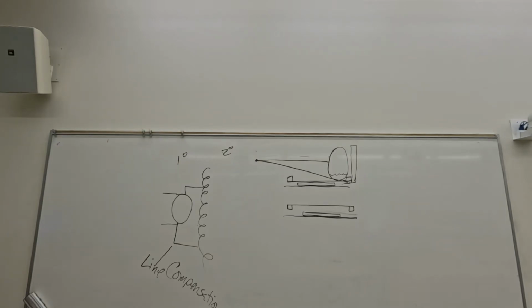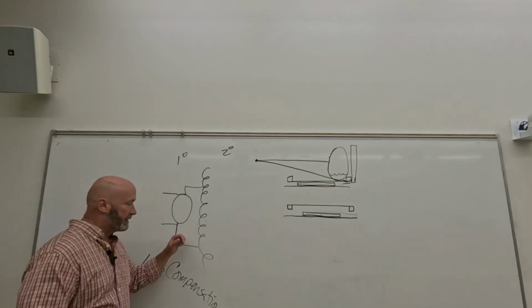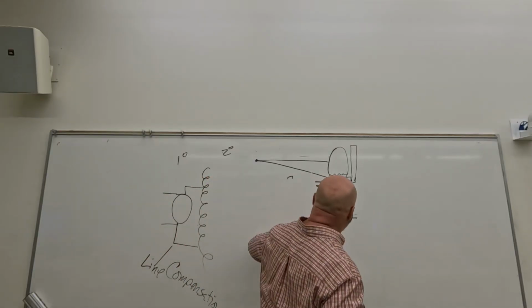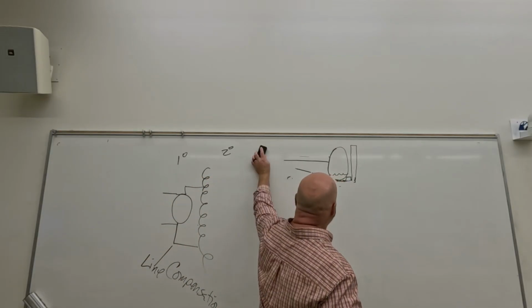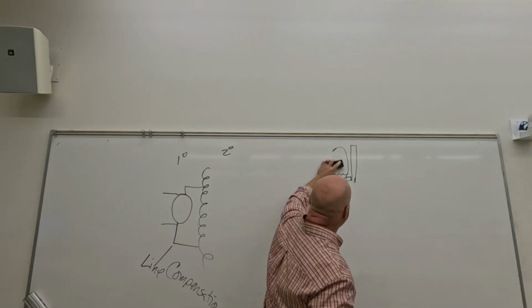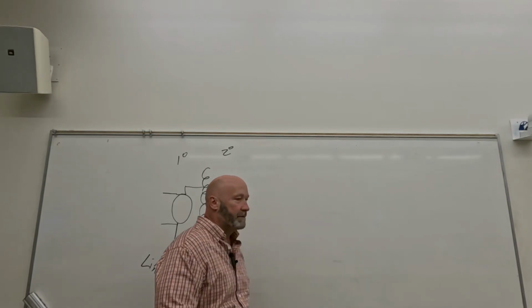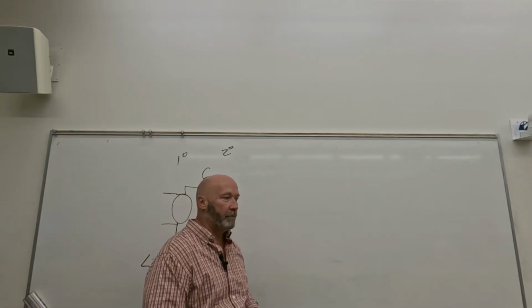All right. So principal parts of the imaging system, we're going to break it down to just 3. That would be your x-ray tube, which is obviously in an x-ray room. The control panel, our operating console is what they'll refer to it as. That's where you do all your manipulation of the beam to control the quantity and quality of x-rays. And we'll talk about everything else that we do, but quantity and quality, of course, is your kVp and your mAs. And then you've got, he refers to it as the high voltage generator.